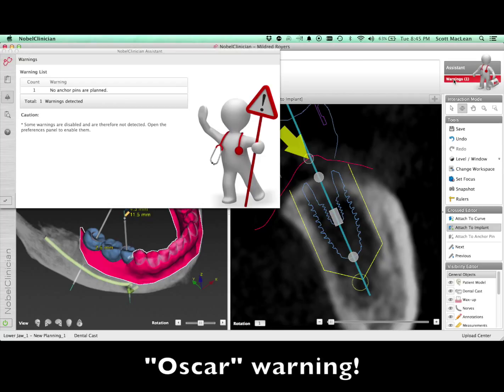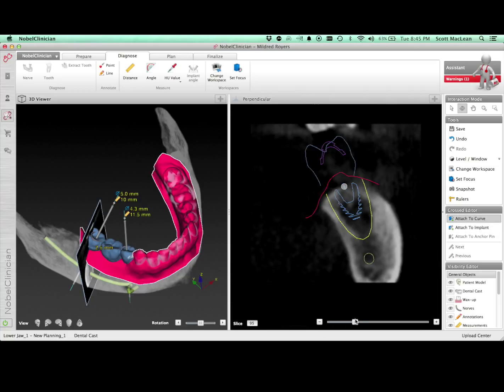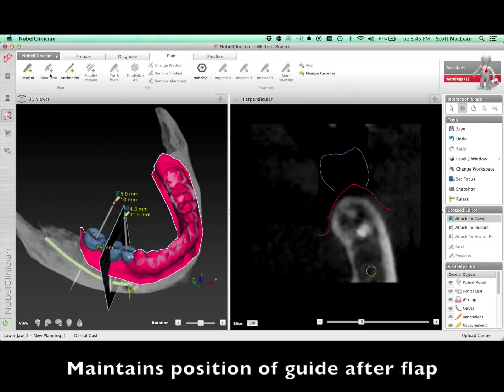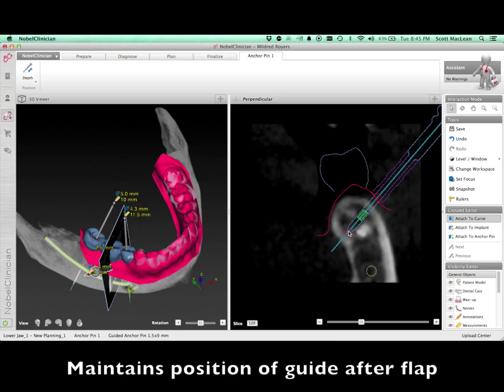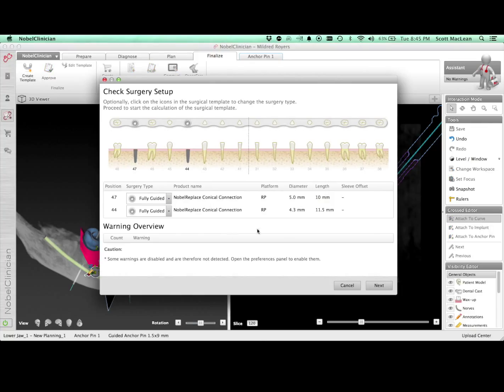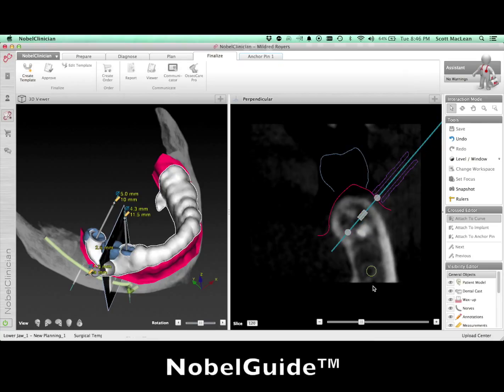There's a warning that shows up in the corner. As I click on it, you'll see that the software is recommending that we use an anchor pin, and I agree with this in this particular case. When we have a distal extension type of implant placement, we want a guide that's going to be stabilized in this quadrant. By doing an anchor pin, it's going to allow us to maintain the position of the guide during the surgery, which maintains the angulation and depth of the implants. If the guide moves, it's going to move the angle of the implants and also the depth. Once we click 'create a surgical template,' this anchor pin is going to be incorporated along with the sleeves we created to place the implants.